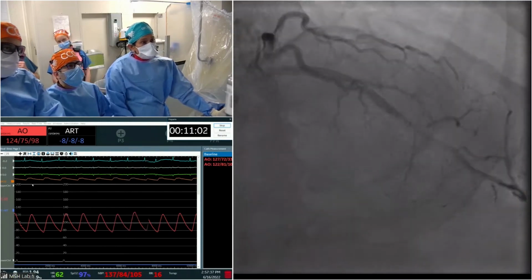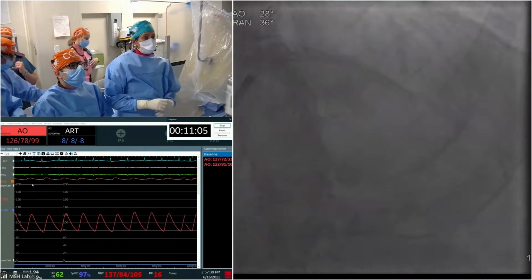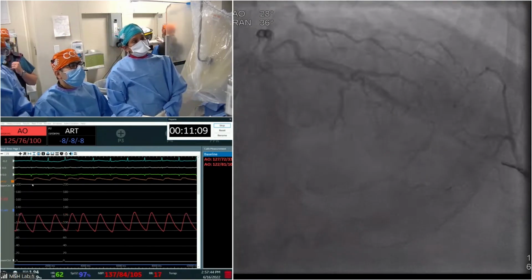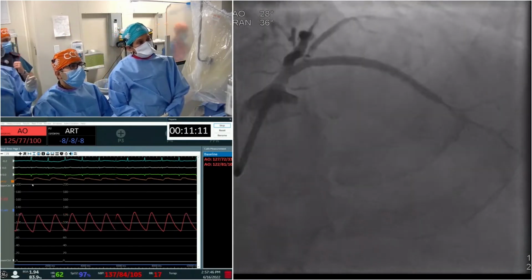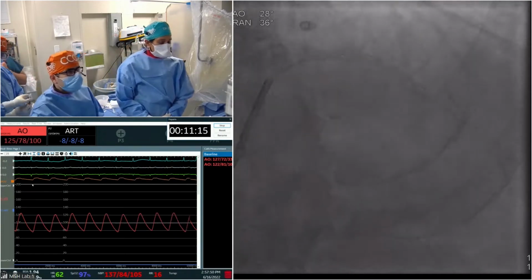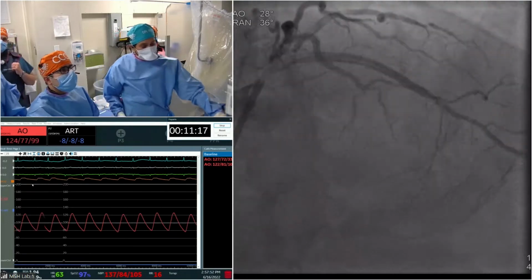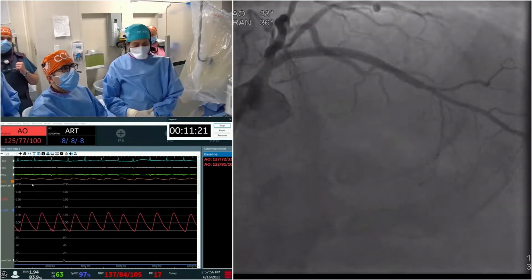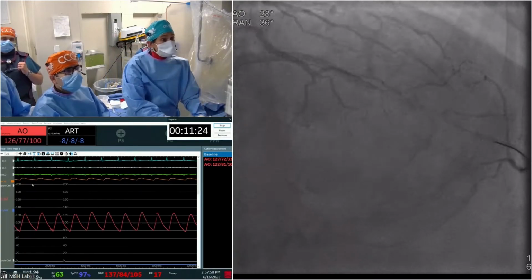Time for some vasodilation. It looks quite severe in this view, the ostial diagonal. That doesn't look severe to you? It's a great collateral to it. Now after stenting, there is side branch stenosis, but I think again same thing. It probably would say 80%, we can recross and kiss. Yeah, I think it's reasonable to do a little recross and kiss.